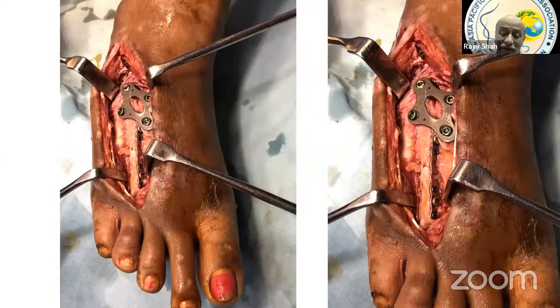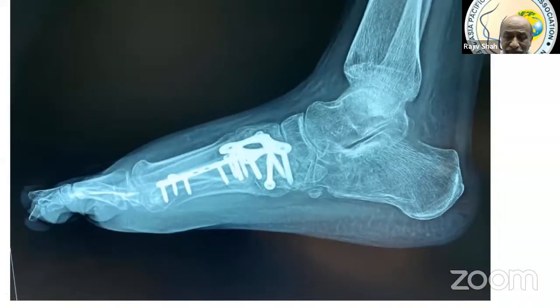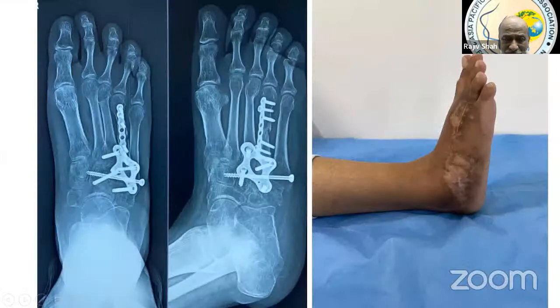So I went in and put in a plate to fix the fourth metatarsal. And then this patient had intercuneiform instability. So if I wanted to build it, I had to put in a screw, which was passed right from the fifth metatarsal base to the first cuneiform to the second cuneiform. So this was the first screw to give stability to the intercuneiform area, and then a plate spanning the third and the fourth ray was passed.